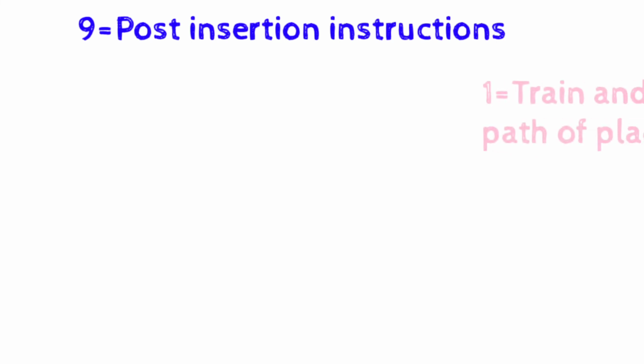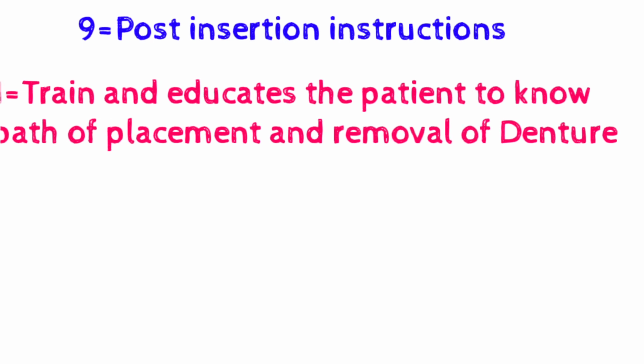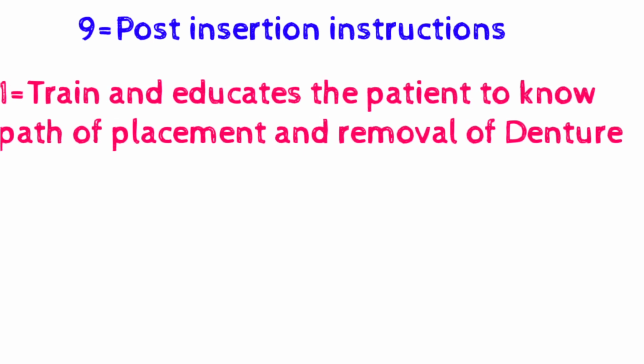Now come to the last topic of the lecture, the post-insertion instructions. Which type of instructions do we give to the patient after insertion of the overdenture? Number 1, train and educate the patient to know the placement and removal of the denture.